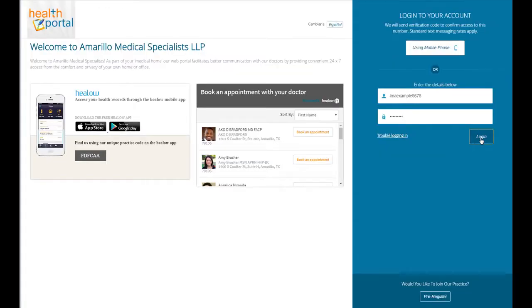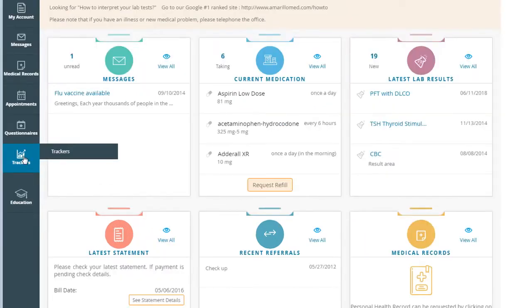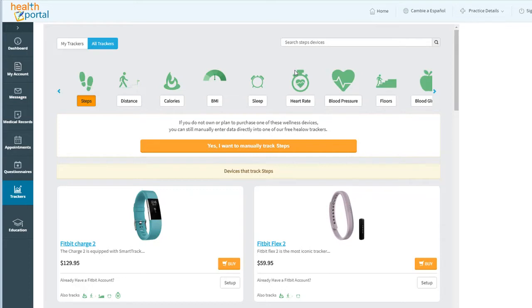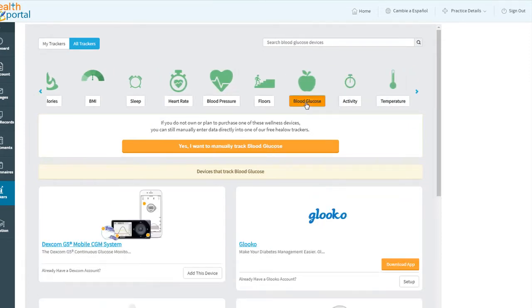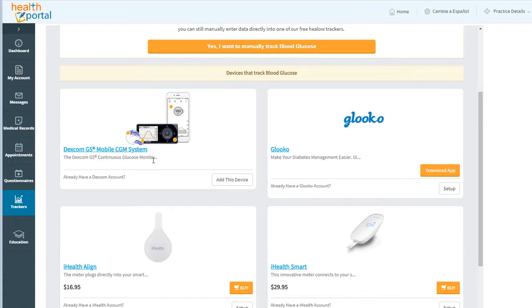I've already entered our example patient name. We're going to log into our portal. Over here to the left column, you'll see an item called Trackers — hover over that and then choose Trackers. The first time you come in, you're going to probably see all Trackers rather than MyTrackers, and glucose may not be immediately available. You may need to hit this little blue arrow to the right to actually expose glucose. Choose Blood Glucose and you'll see a list of tracking devices you can use with Hilo, including the Dexcom G5 CGM system. Trust me that G5 and G6 both work with this link — you don't need to worry about which model you're on.